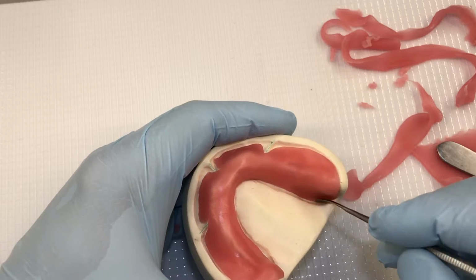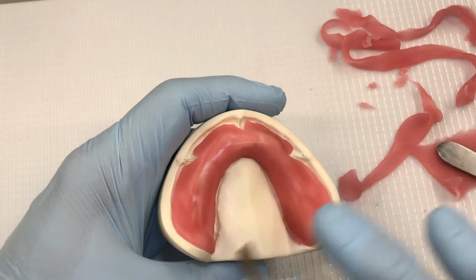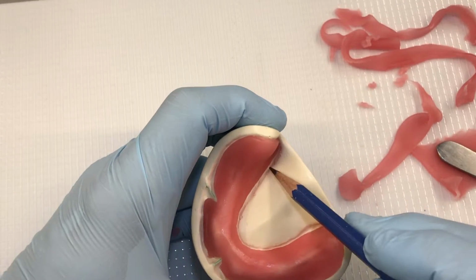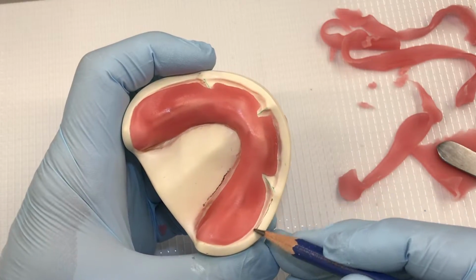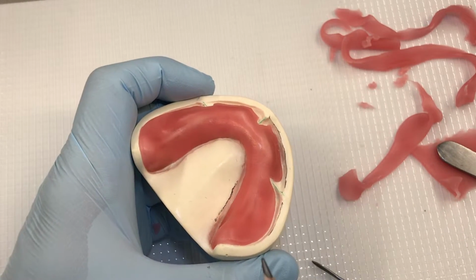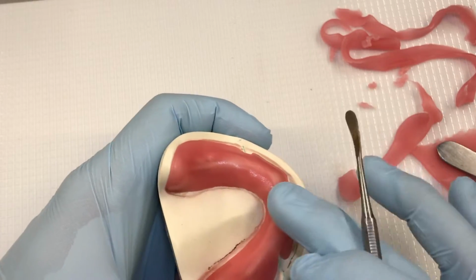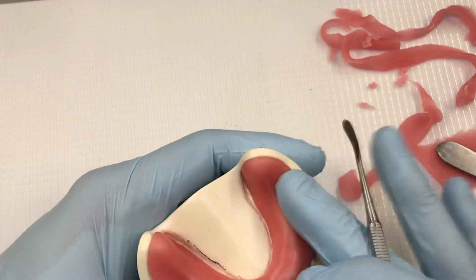Now this, you don't have to go back and polish it with your hand like I did on the upper, on the palate, because everything is going to be covered in wax. So we can create that nice smooth finish in wax. Just make sure that you have adequate space between the base plate and the edge of the land area, which is here on the lingual. Same thing on the other side. And here on the facial. So I have that space in there that I'm going to fill up with wax. Just a final check here. And this goes a long way to ensure that you have good adaptation of the material to minimize the work in the clinic.